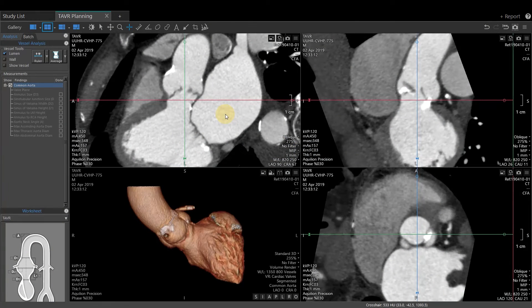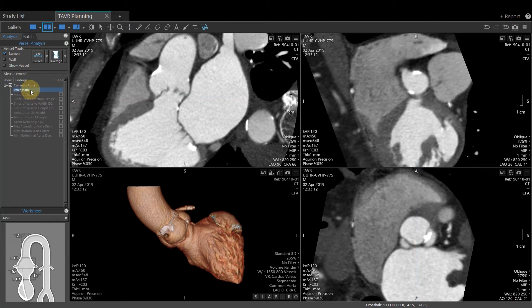It is often useful to display a temporary crosshair in Vitrea while navigating through our images. In this particular example, we are in the TAVR protocol. As soon as we activate the valve plane measurement, the valve plane tool is active, and we do not have a crosshair reference line.